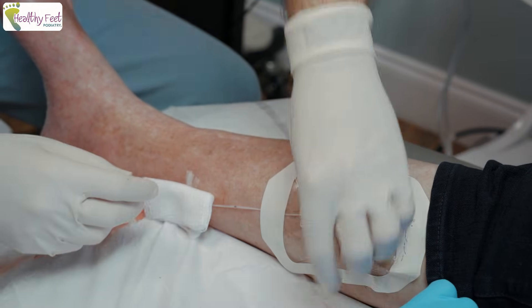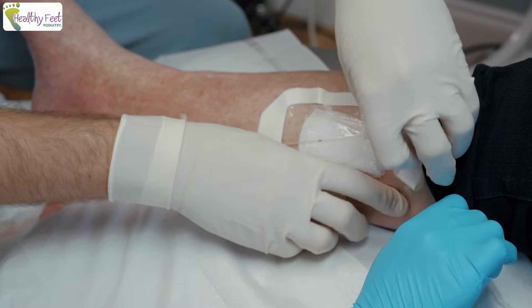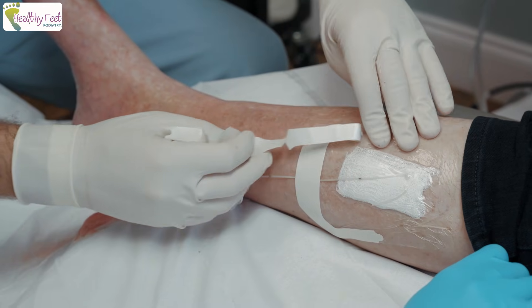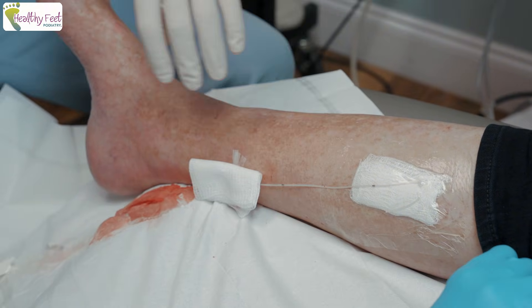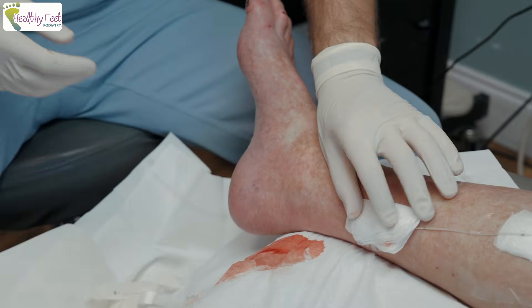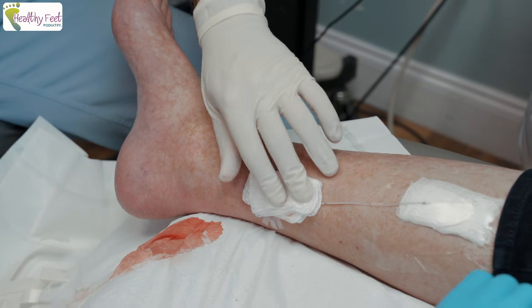How do you like combining biology with technology? You've had pretty good results with this so far — patients are coming back. We just booked another one, and I think we're doing that other permanent one soon.